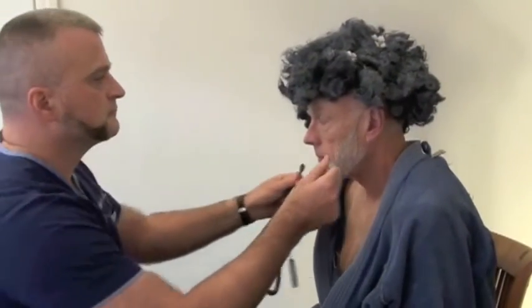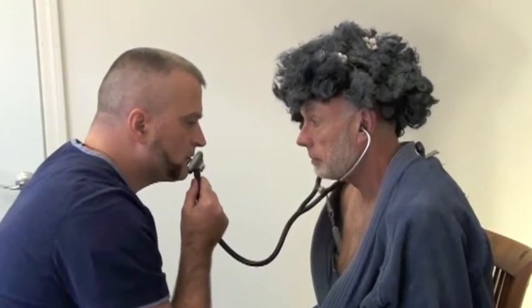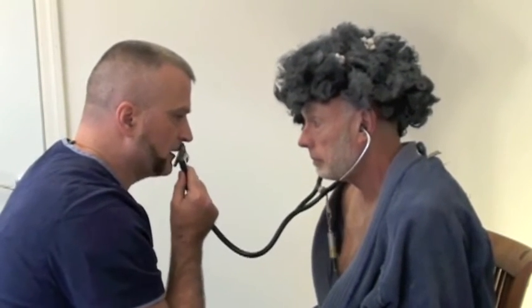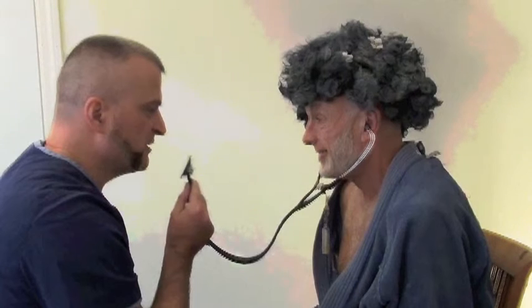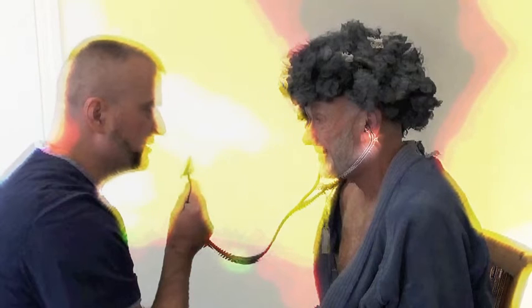There are all kinds of ways to boost a patient's hearing in the department. One way is to simply reverse your stethoscope and put the earpieces on them and speak closely into the diaphragm of the stethoscope. While this works really well, there's one problem. They have your stethoscope. You can't really leave it with them, but you also aren't the only person who needs to talk to the patient. Nurses, radiology technicians, social workers, and consultants are just a few of the people who will need to be able to communicate with your patient.